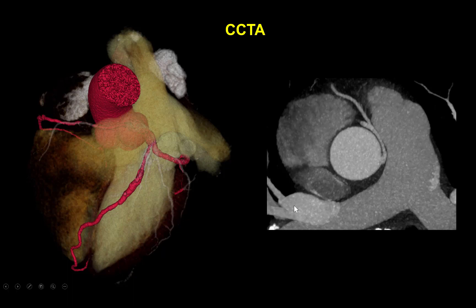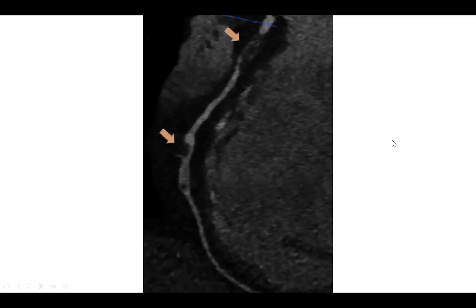The solution came from coronary CTA, which is the modality of choice for determining the presence and location of anomalous coronary arteries. It demonstrated that the right coronary artery was actually originating from the left cusp, very close to the origin of the native left main. This explains the difficulties in engaging it. Moreover, there was significant disease in the proximal and mid-segment of the anomalous right coronary artery, with actual formation of aneurysms.